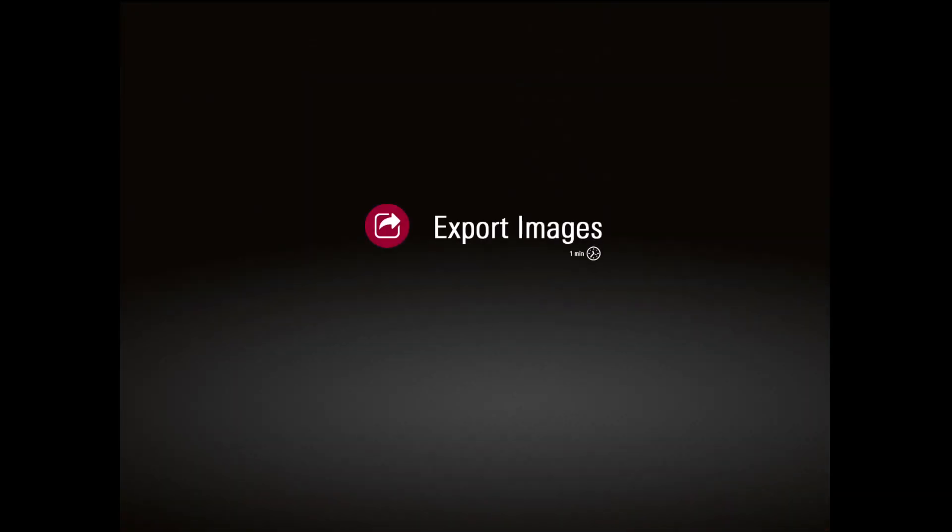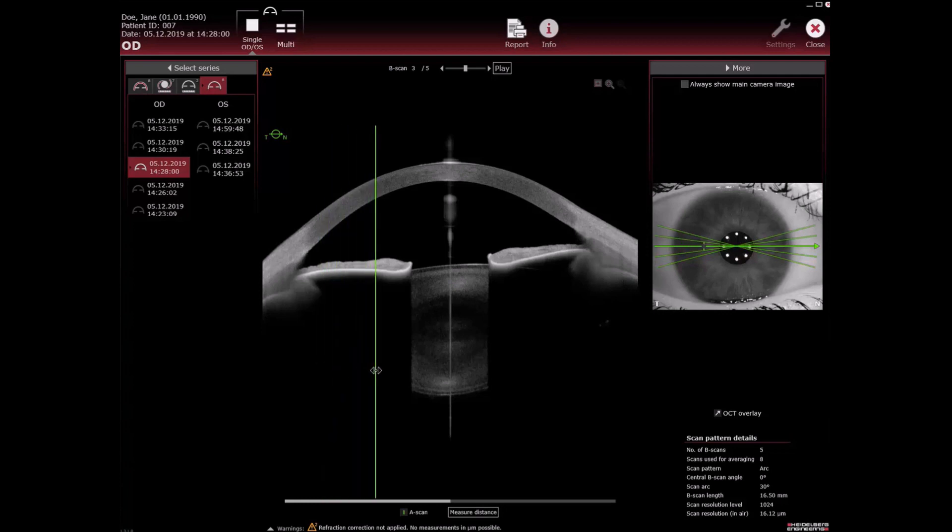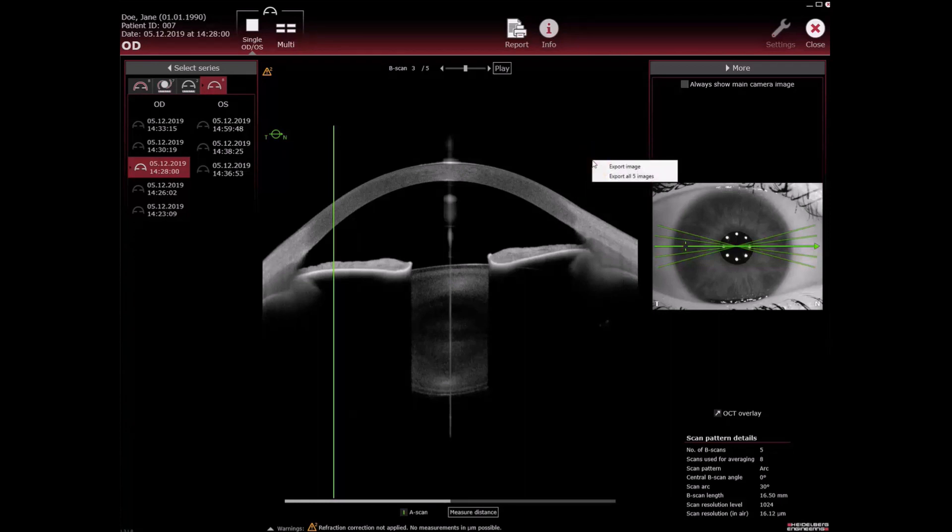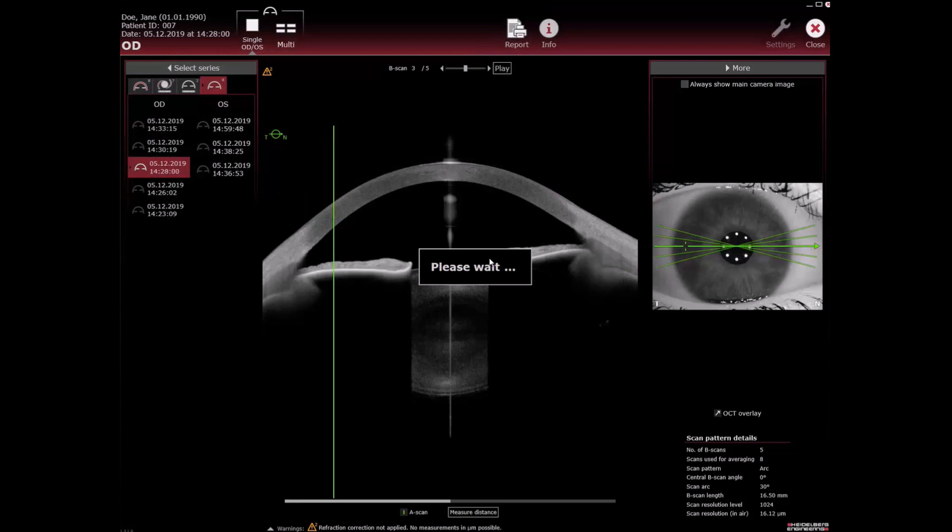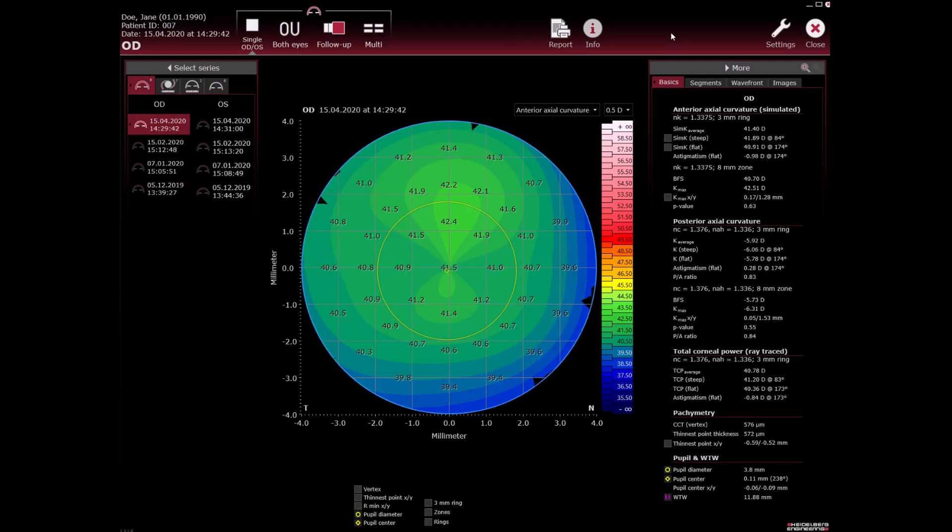Export images. If you want to include overlays in the exported images select the desired overlay first. You can export the displayed image only or all images belonging to the examination. Right click the IR image or the OCT section image and then select export image or export all images. To export images from cornea application, select the images tab to display the necessary IR images and OCT section images and right click them.